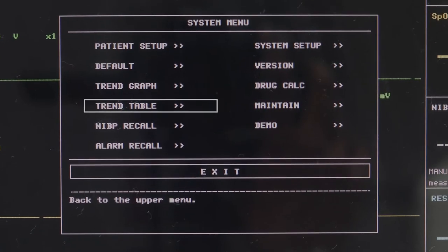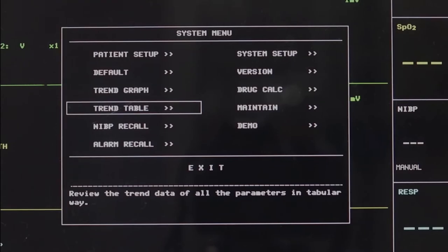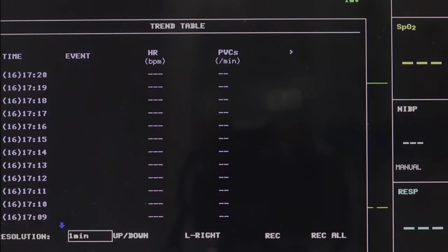The latest 480 trend table data can be displayed at every 1, 5, 10, 30 or 60 minutes.